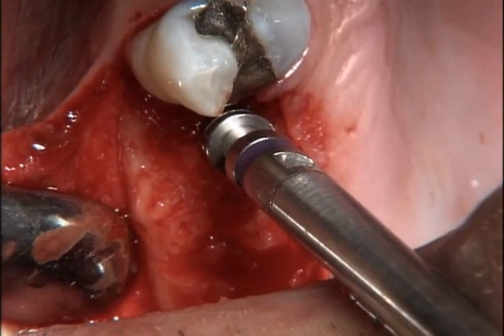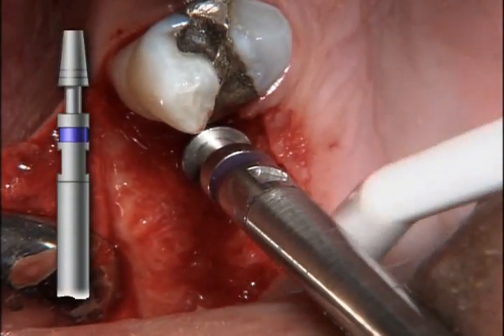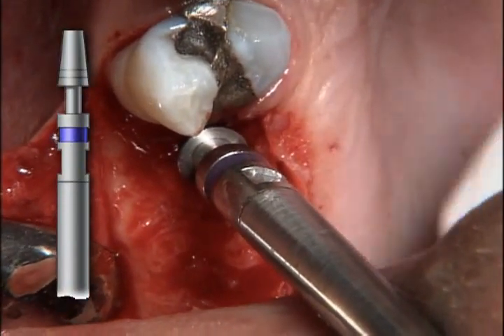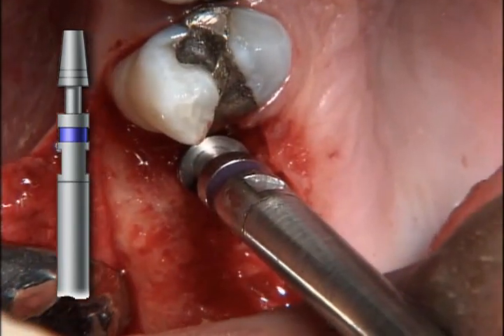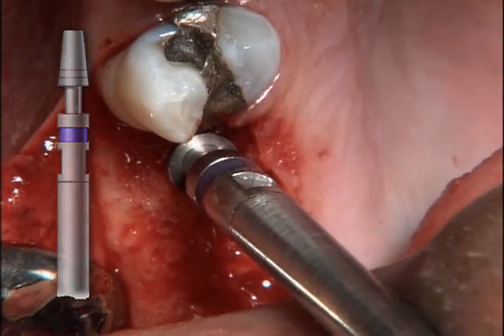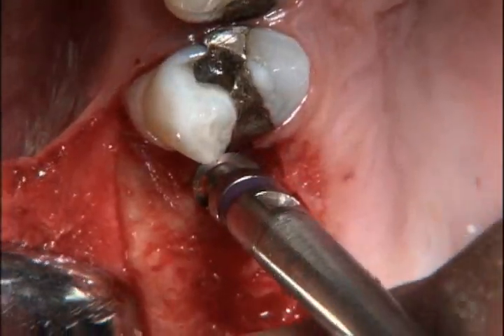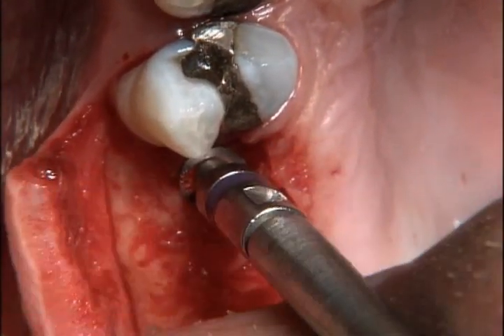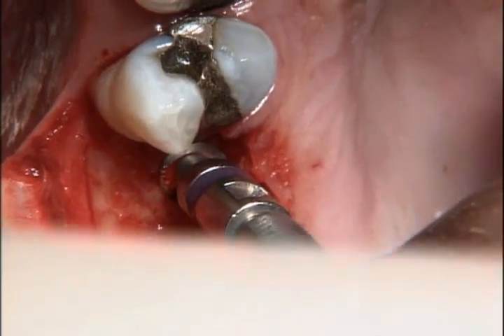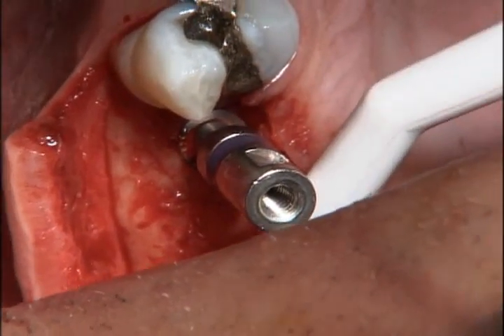In order to finish the development of the osteotomy, the trial fit gauge corresponding to a 7 millimeter long by 4.1 millimeter diameter Endopore implant was connected to an osteotome handle and fully seated with the use of the surgical mallet. At this point, the handle was disconnected from the trial fit to allow the latter to be used as a direction indicator for the development of the second osteotomy site.